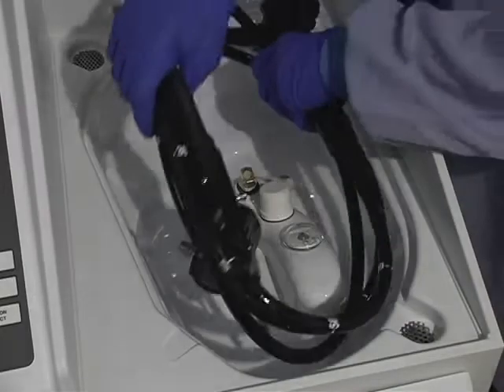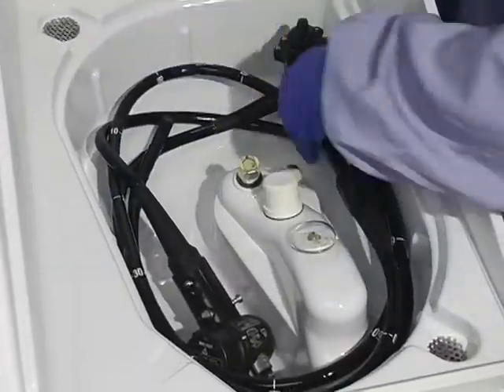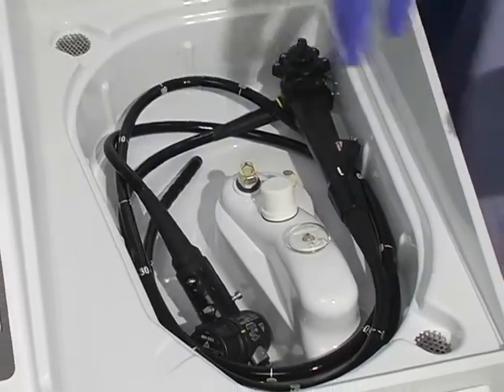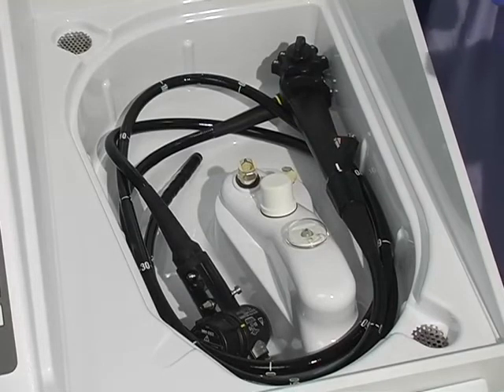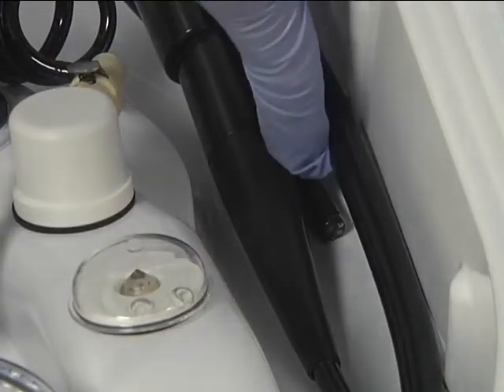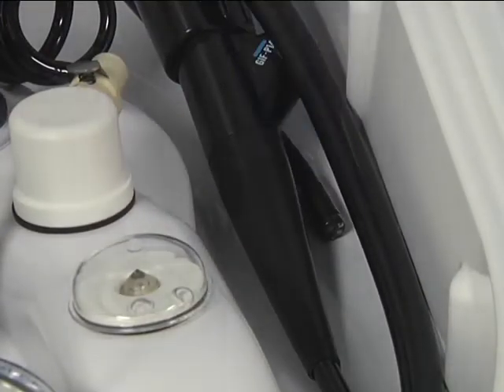Pre-coil the endoscope before placing it inside the basin. Hold the endoscope by the control section. Loop the light guide cable so that the light guide connector hangs about one foot below the control section. Loop the endoscope insertion tube in a similar way. Place the control section at the right rear of the basin and the light guide connector at the left front. The distal end should be positioned so that fluids passing through it into the basin will be clearly visible, and tucked under the scope to ensure that water or disinfectant doesn't shoot up onto the floating lid.